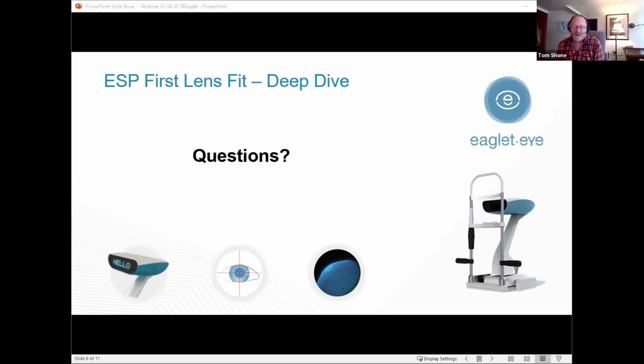Well, I find it is, and in most of the cases the base curve and the sag all match up. But there are cases where especially that base curve prediction with the sagittal height really can help that limbal area. I think in the algorithms, and Renier has that, I've learned over the years to listen to him and to understand the technology, but you can just accept it and use it, which is even better. But it really does get that limbal zone locked in.